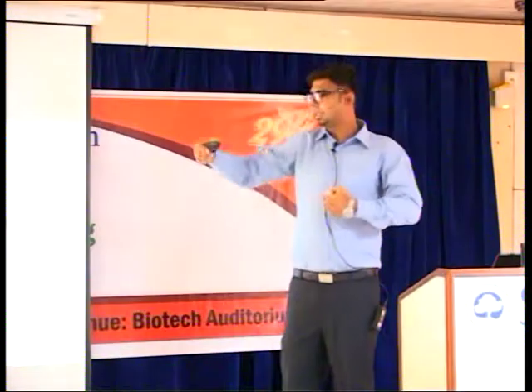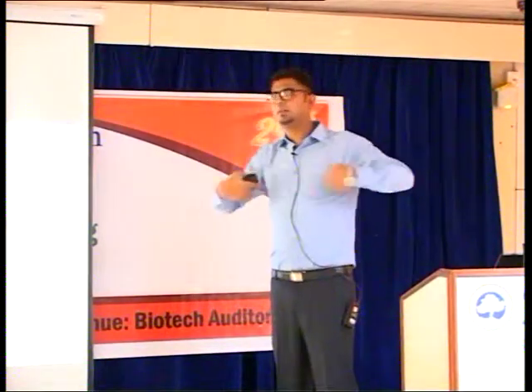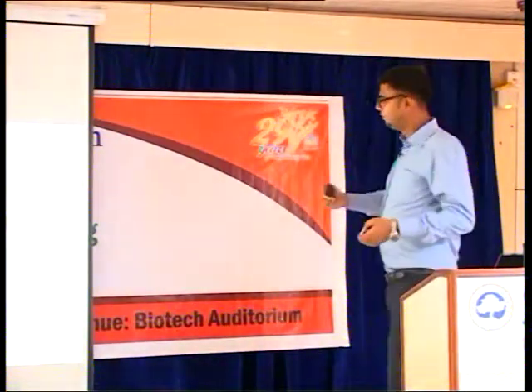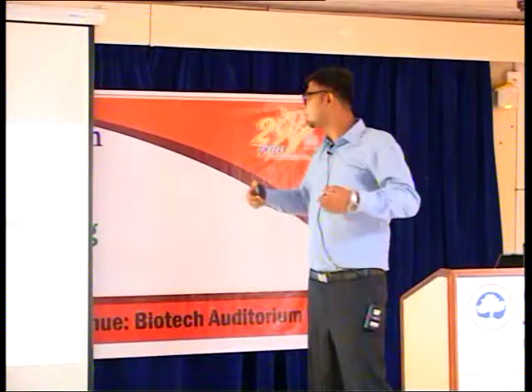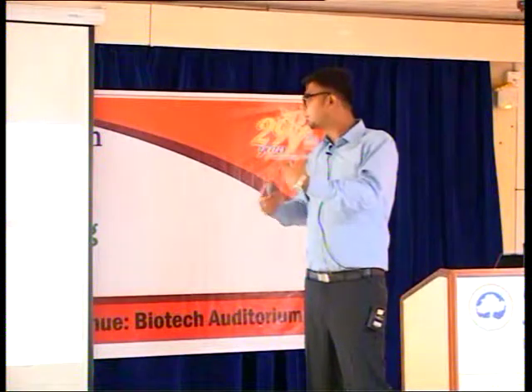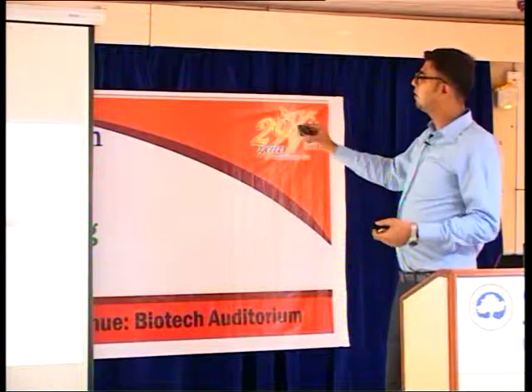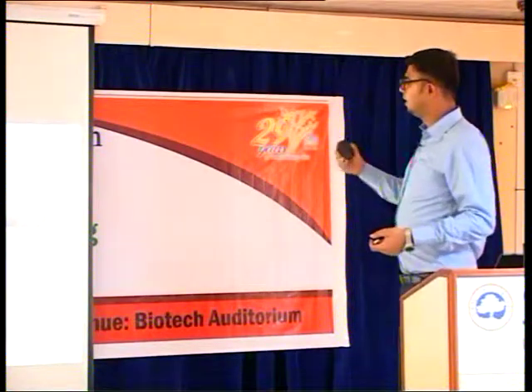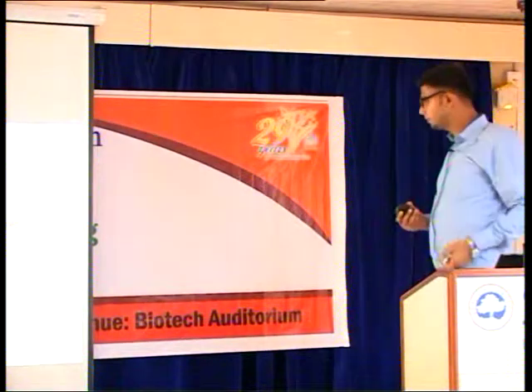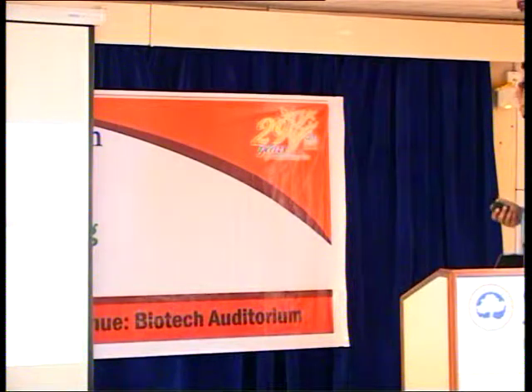But when the X-ray tube comes on this side and the detector is on this side, the width is more, so you have more dose. Nowadays technology has come up which keeps changing as per your anatomy. In earlier days, the same dose was there for this depth, for every area. But nowadays it is specific so that you are exposing less to the patient. And this is a very vital thing in the present industry.